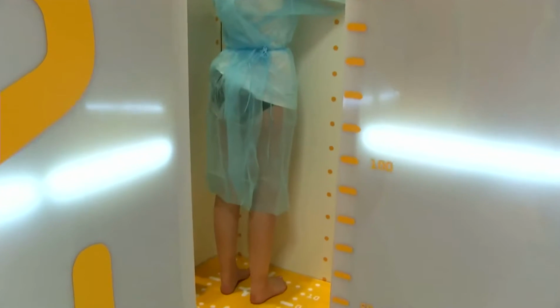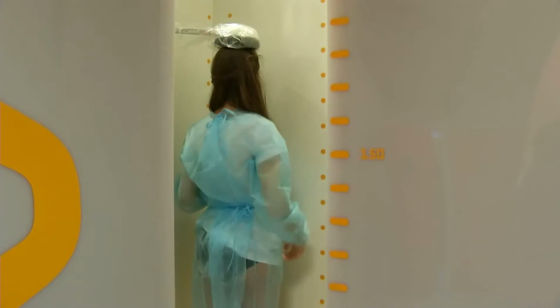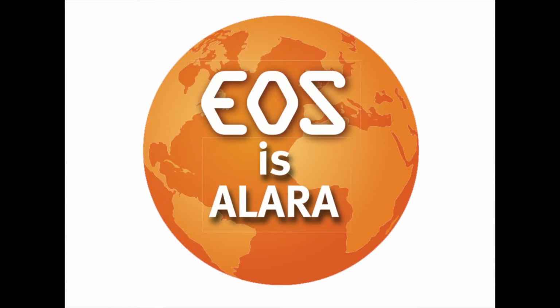Especially in Europe now, we have a regulatory obligation, which is a very simple principle, which says that you should use the minimal dose which is necessary to achieve one special diagnosis. This is the ALARA concept, which means as low as reasonably achievable.